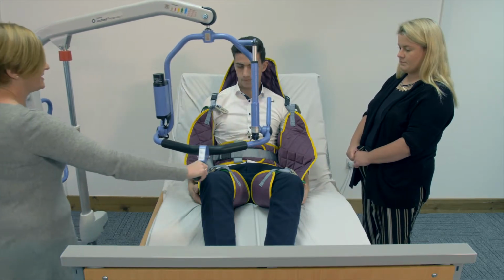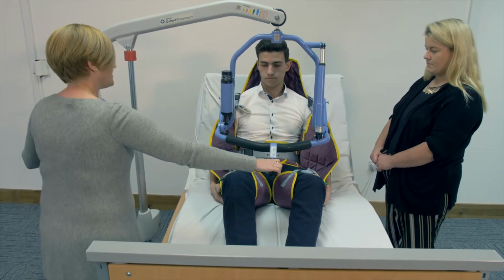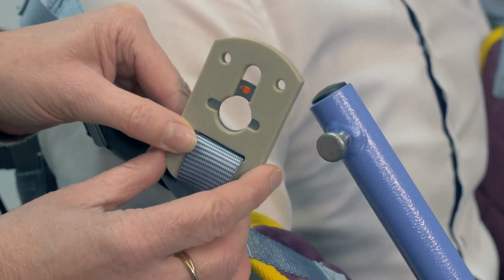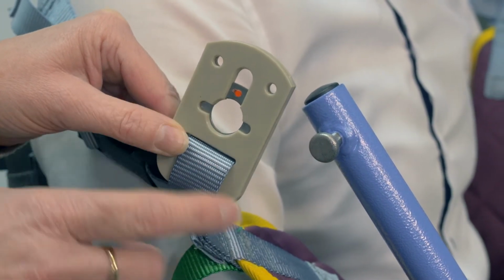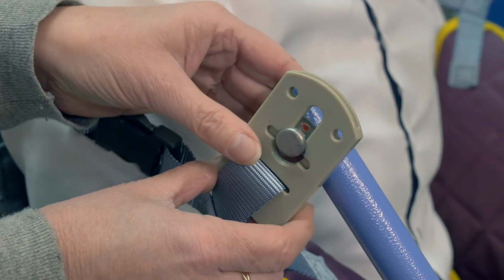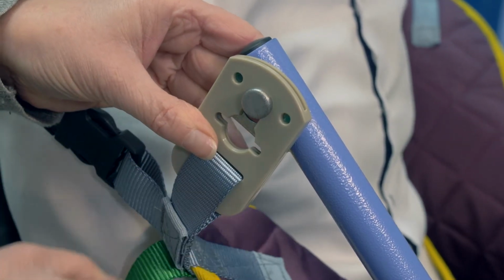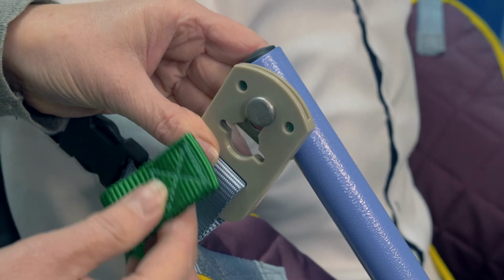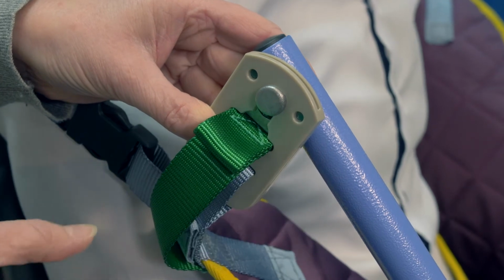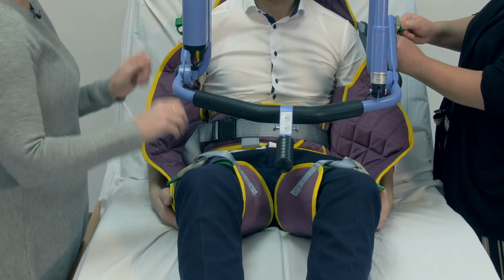So we'll bring the hoist in carefully, line it up with the shoulders and the leg straps. To fit the sling to the hoist, you have to check that the red dot is showing to show that the clip is currently unlocked. Then you position it onto the hoist and pull down until the 2 green dots appear, and that shows that it's locked. As an additional security measure, you post the green webbing strap through the hole, and that means that the sling cannot detach itself.